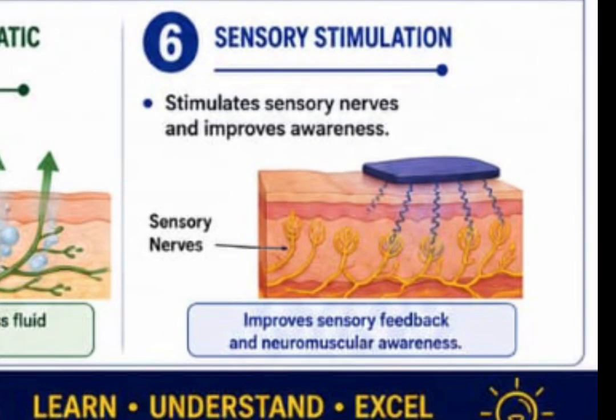Also, when you are stimulating sensory nerves, you make the primary somatosensory area of the brain aware that the nerves are very functional, especially in patients that have impaired sensory function. If they have impaired sensory function, when you continue stimulating the motor point around that area, it stimulates surrounding what? Nerve endings, which are the nociceptors, also the Pacinian corpuscle and the Meissner corpuscle.